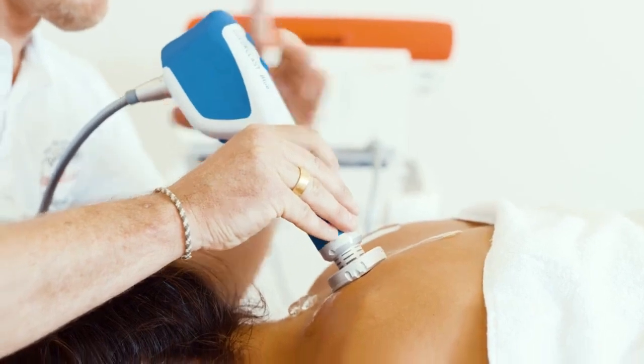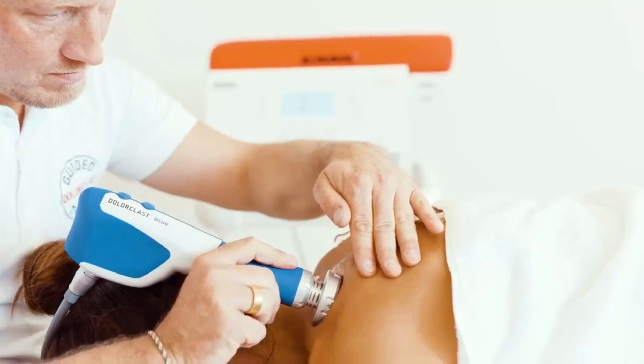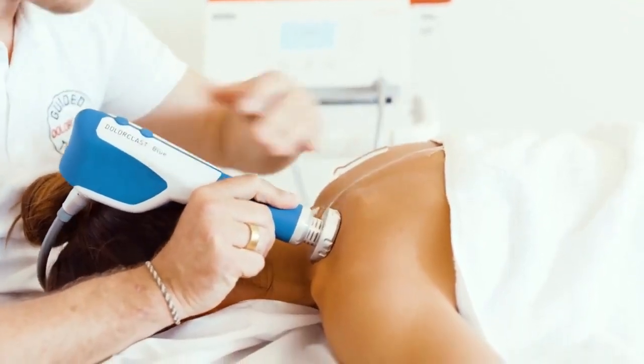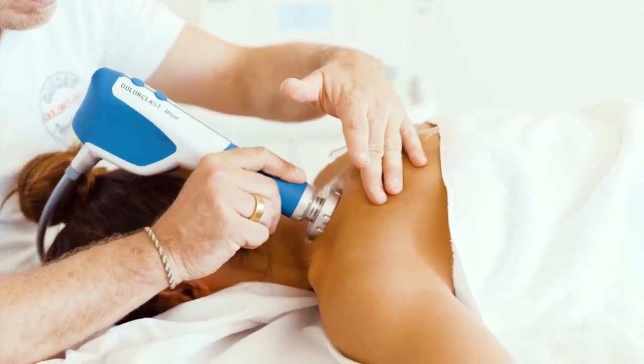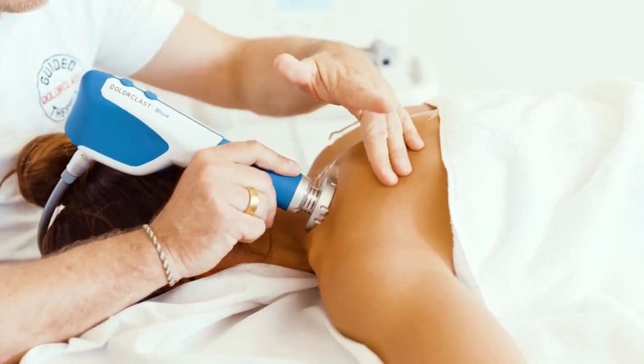The energy delivery may be adjusted during the treatment to deliver the required energy levels. It is possible to change the handpiece holding position and also possible to use the free hand to increase the stretching of tissues or to improve the contact with the applicator. Finish watching the video for a full demonstration of the treatment.